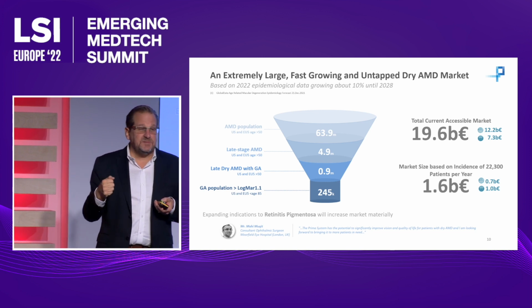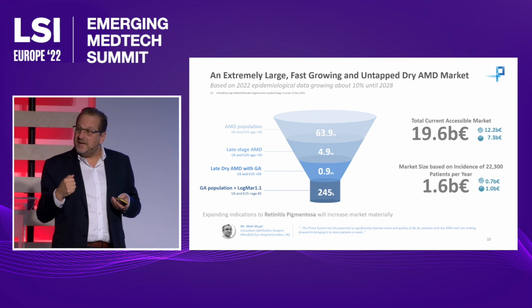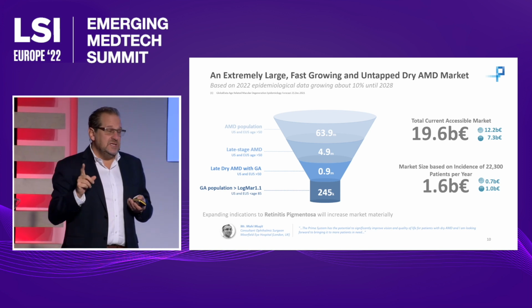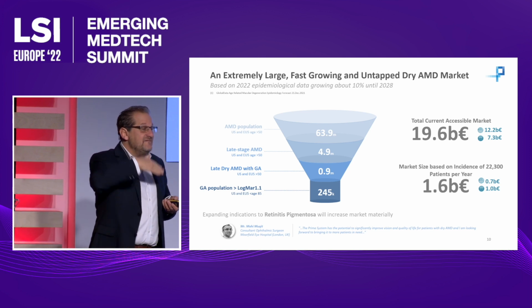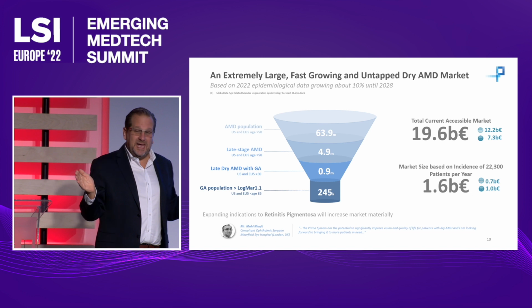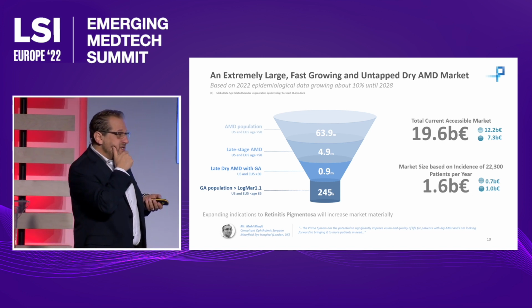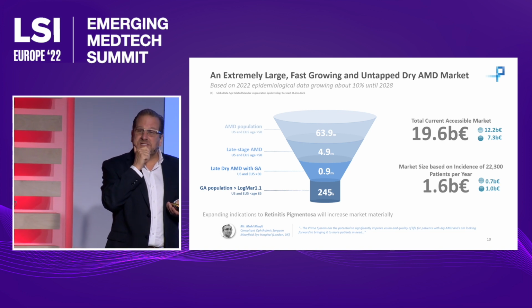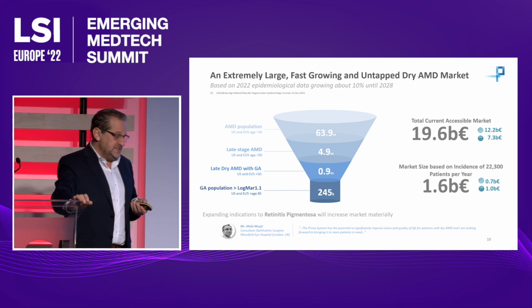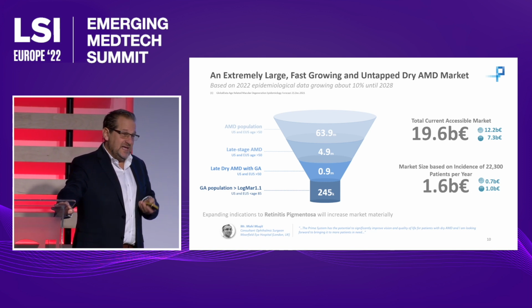And then in addition, as they progress, we'll do other tasks such as reading train schedules and then taking them outside in the hospital setting and asking them if they can actually find their way through a hospital without any assistance. So the point that I want to make here is that for dry age-related macular degeneration in the advanced stage of the disease, these patients are completely dependent on others. What I would say is the average age of onset of dry AMD is around 60 years old, and by the time the patients are in their 70s, if they're going to progress to blindness, that's usually at the stage that it occurs.